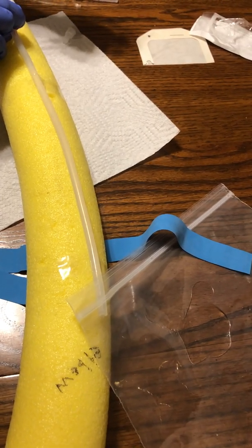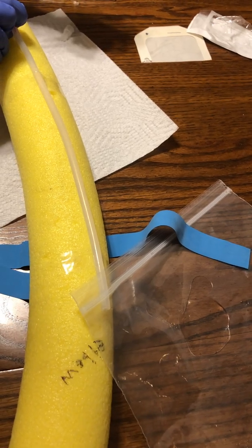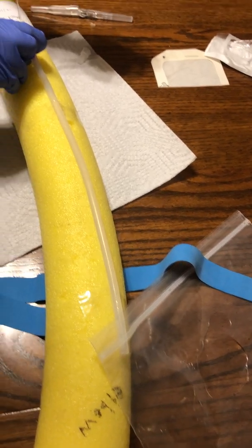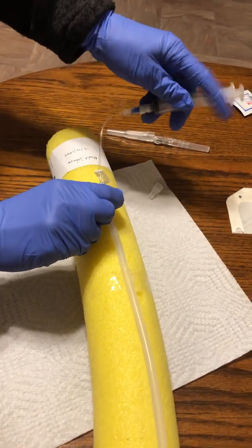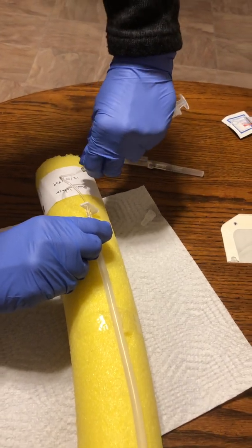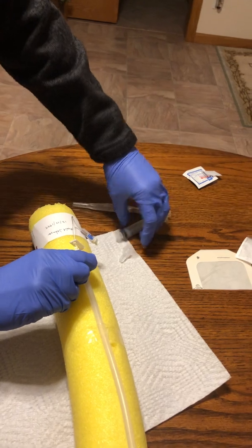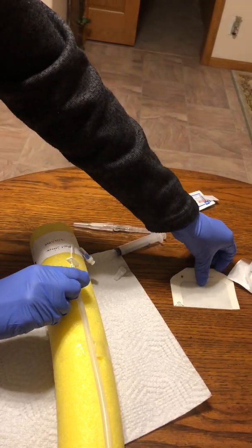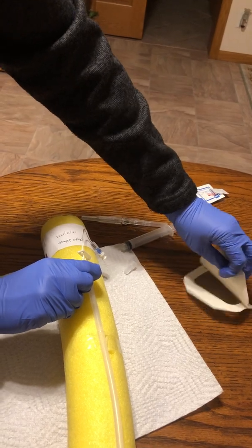Then I'm going to make sure that there is no redness and no swelling at the site and that there's no pain. So I want to take this off. Saline. Next, I'm going to put on my bandage.